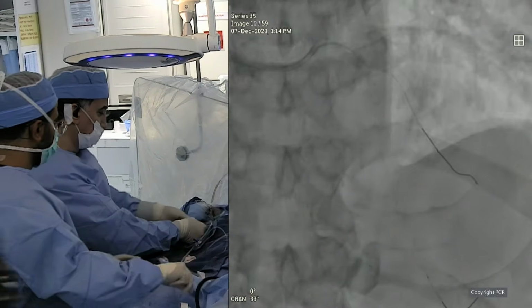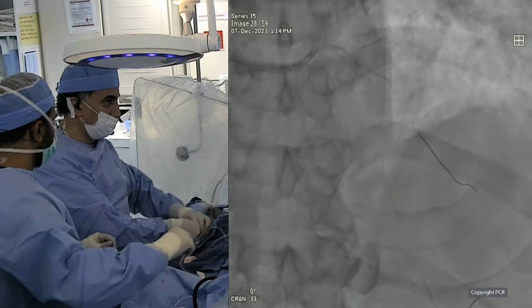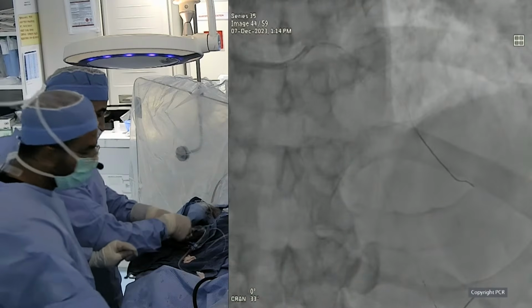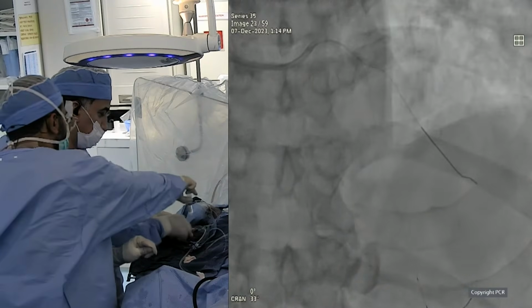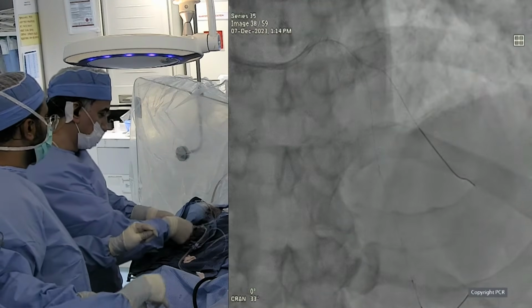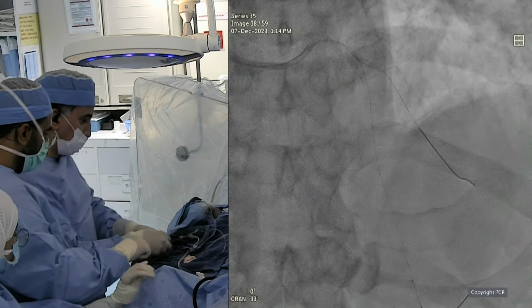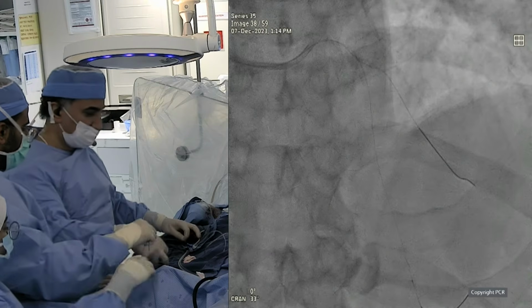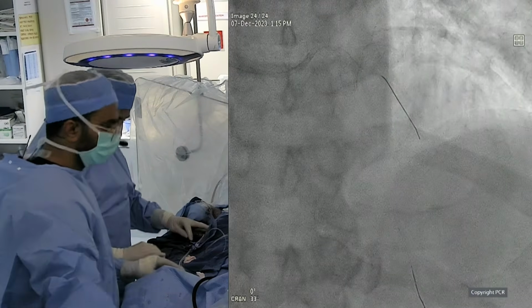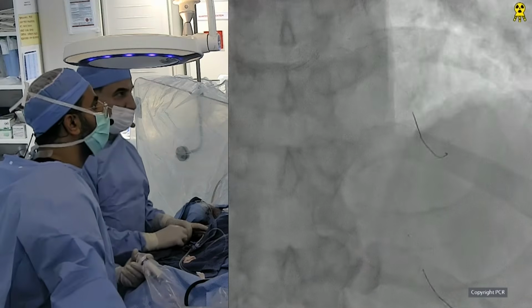Julio, I have a question. The proximal LAD is a very elliptical artery, almost elliptoid. What's the sizing before the stent is coming in? That is the point. OCT is not only morphology, OCT is morphology plus measurements. So now when they finish, we can go back and use the automatic measurements to understand. We fixed that the distal part is at least 2.75, so perhaps a 2.75 stent, then it is very long, and then we need to take the measurements approximately.